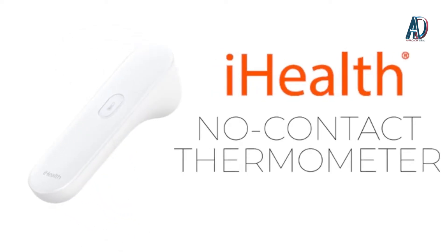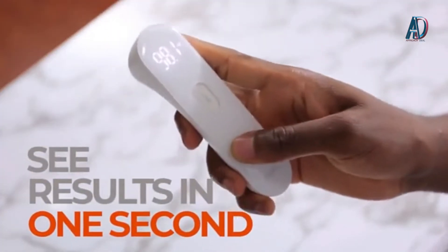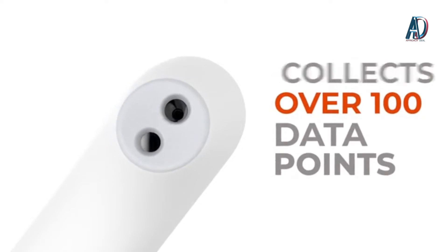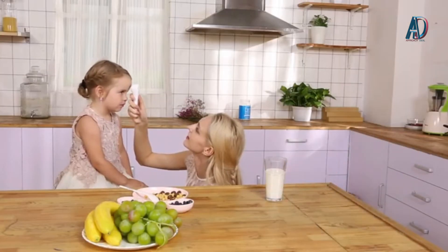Introducing the iHealth No Contact Thermometer. Measure your temperature instantly — you'll see results in just one second. The infrared sensor collects more than 100 data points, getting accurate results every time, so you can feel confident when you're keeping a close eye on a kid with a fever.